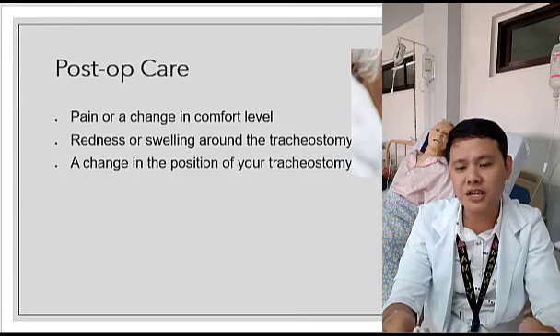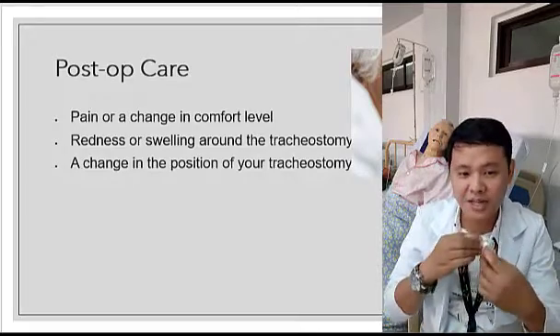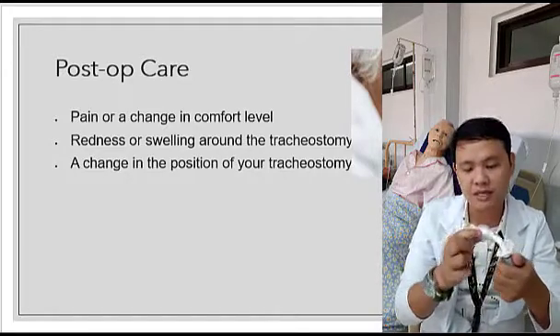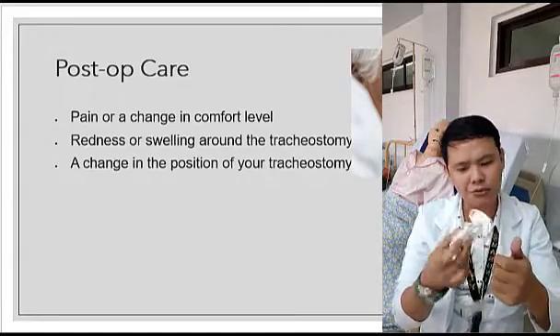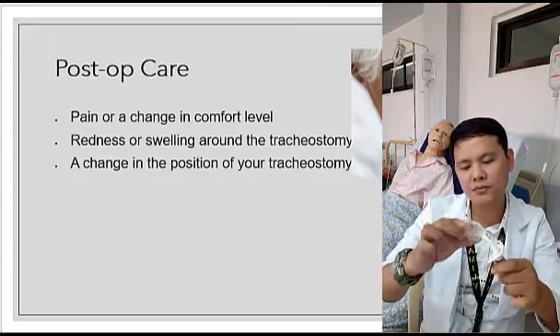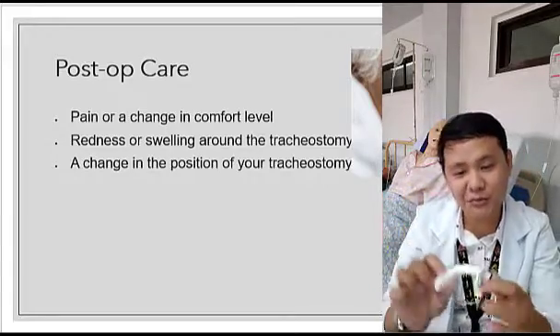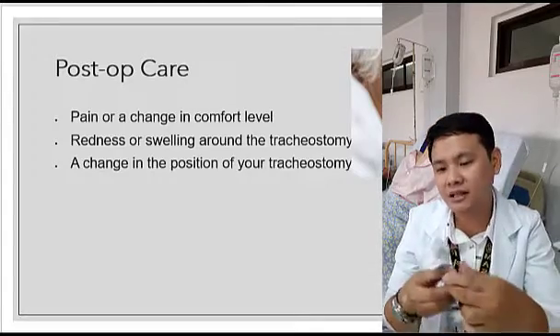Okay, ano pa? A change in the position of your tracheostomy. Biglang nagbago yung placement. Nagkaroon ng displacement or misplacement na yung ET tube. Maybe nagkaroon po ng sira doon sa may cuff natin or doon sa may anchor, the balloon. Although it's really tight and also this one is matibay. As you can see, kahit i-pinch ko yan, matibay po ito. Pero if ever na magkaroon lang ng puncture, magkakaroon din ng displacement.